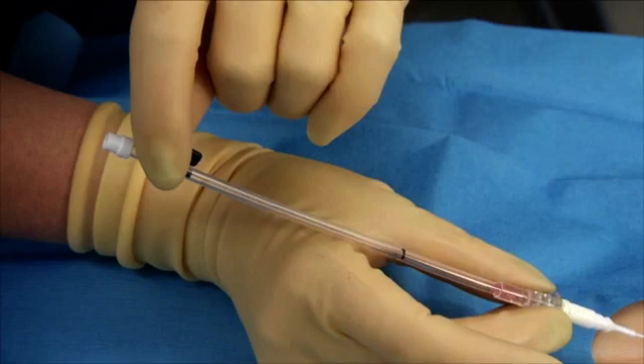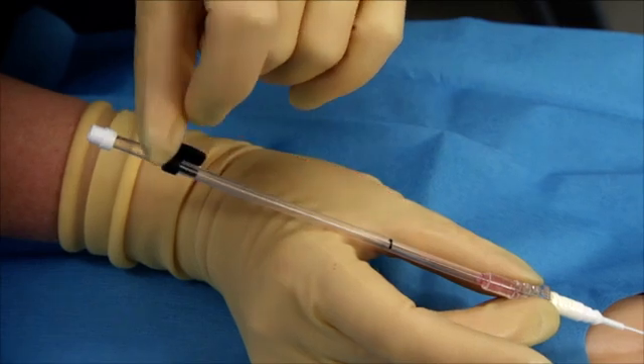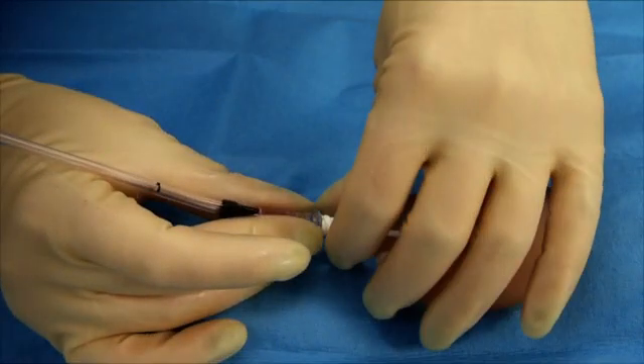Lower the placement device assembly slightly. Stabilize the position of the catheter and attempt to advance the spring wire guide into the vessel using the spring wire guide handle. When the spring wire guide handle reaches the black line on the tube, this indicates that the tip of the spring wire guide is located at the needle tip. If resistance is encountered during spring wire guide advancement, withdraw the entire unit and attempt a new puncture.